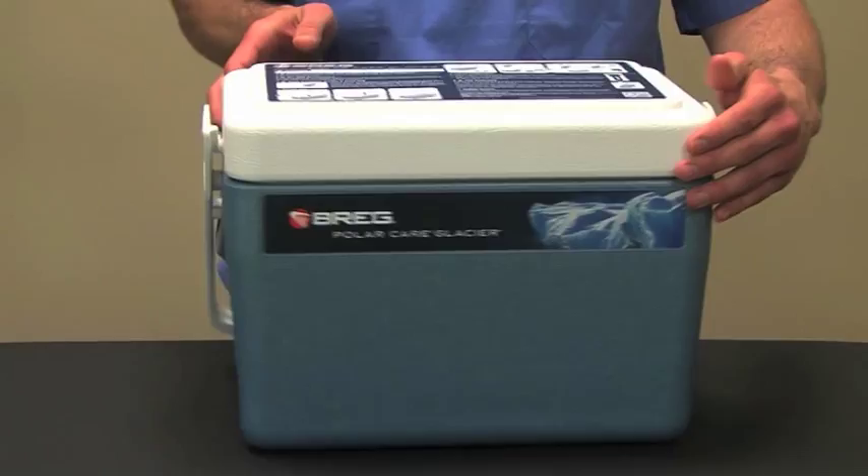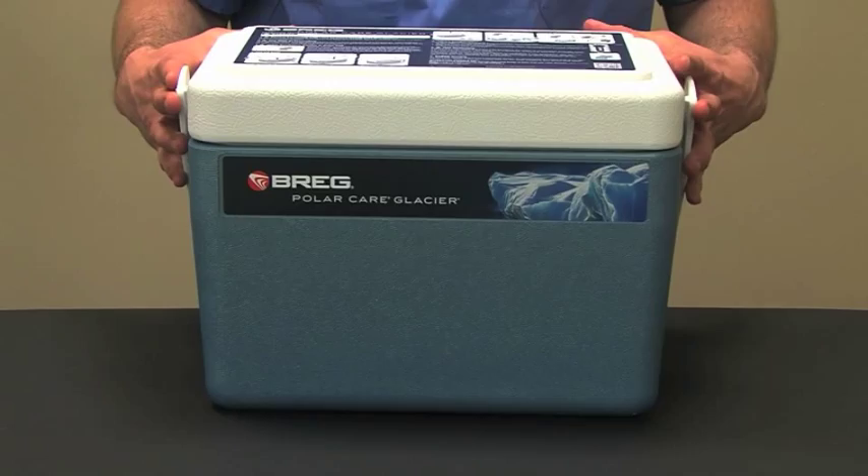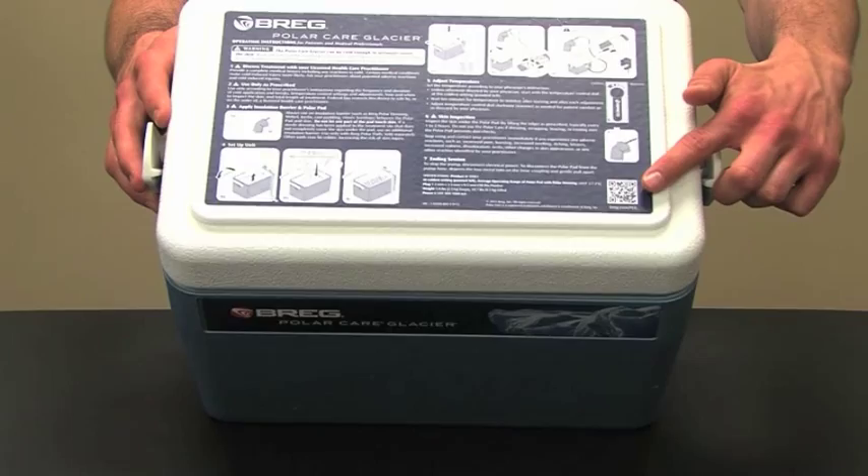If you need a reminder regarding how to use the PolarCare Glacier, refer to the operating instructions printed on the top of the unit or the product insert in the pouch on the back of the unit. Upon discharge, augment your verbal instructions to the patient or caregiver by showing where these instructions are located. There is also a patient video that can be accessed by scanning the QR code on the operating instruction label with a QR-code-enabled smartphone or by visiting breg.com.